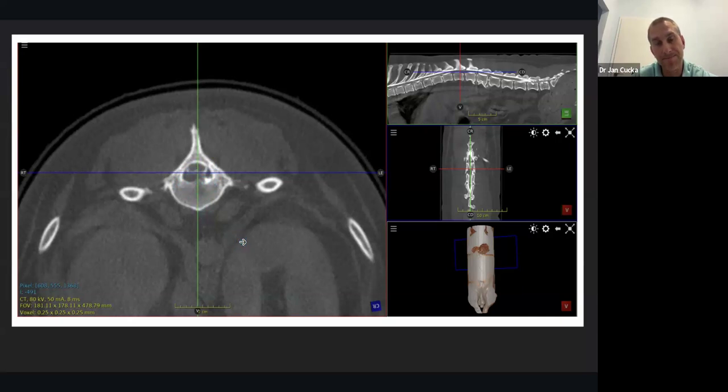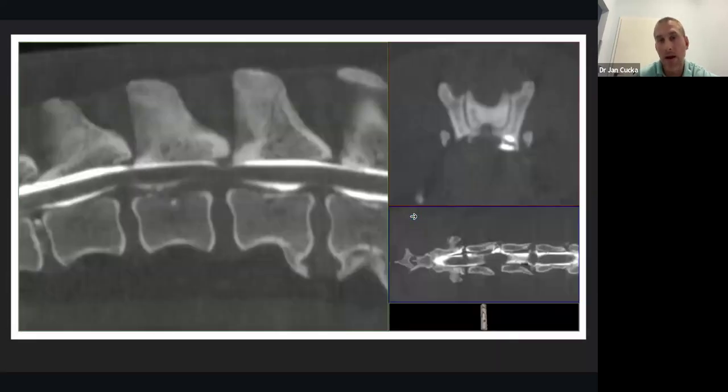So in those cases, without myelo, you couldn't perform surgery well, because you are not able to know exactly where to do it. So on the transverse view, it was very clear, and we have some more details here.